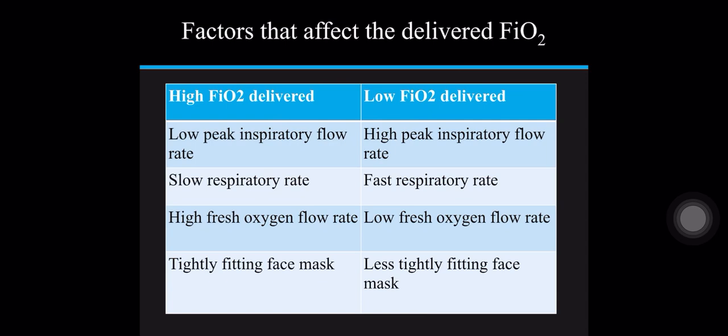There is no doubt that the higher the fresh oxygen flow rate, the higher the FiO2 delivered. And then tightness of the face mask to the face is also important in determining the FiO2 delivered. This may be a problem in patients with a beard, and in edentulous patients, meaning patients without teeth.